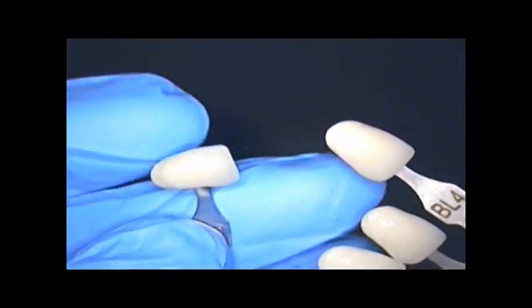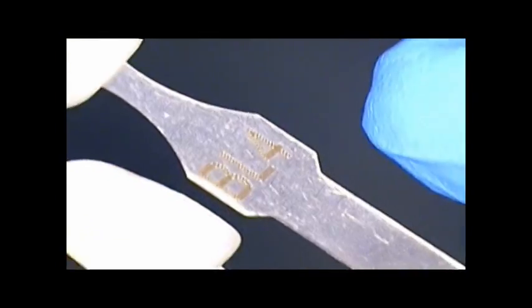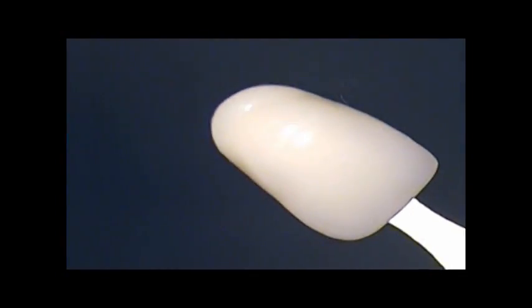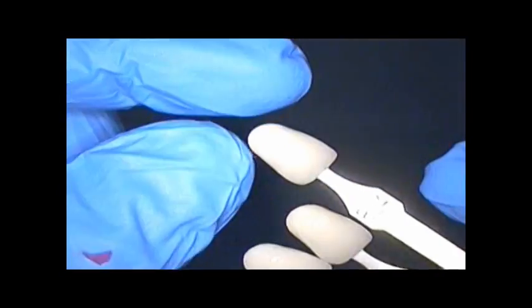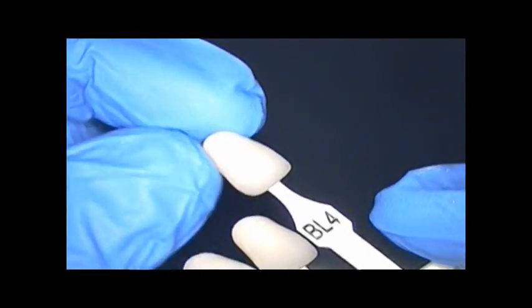Now we use, I believe, BL4 from Ivoclar for the Emax on number 3. We'll let that light adjust a little bit right now. We're getting a little reflection. Here we go. So B1 was a little too yellow, so we decided to go with BL4. And I believe she's an ND5 for a stump shade. So you can see the contrast between the two. BL4 just brings a little lighter look to the tooth, and she's very happy with that.